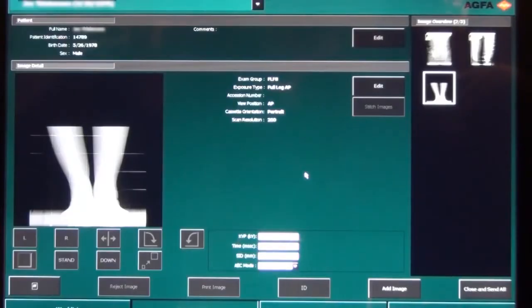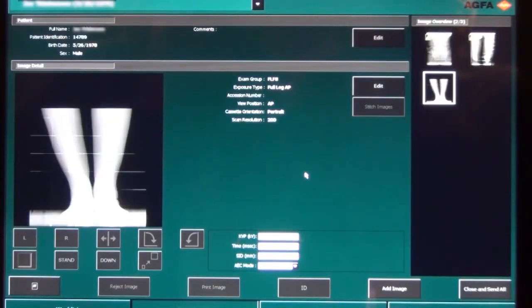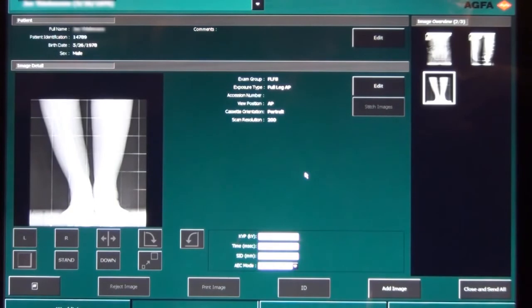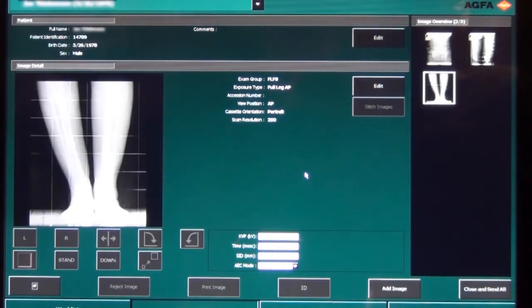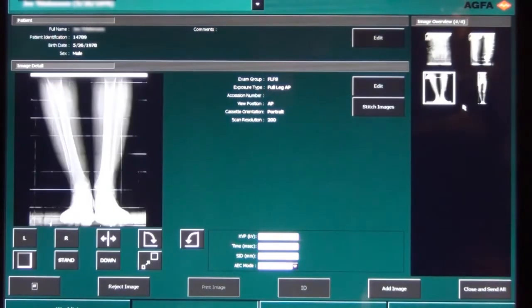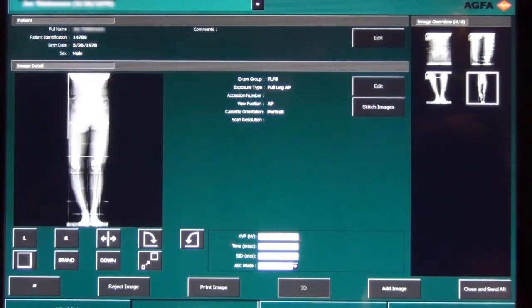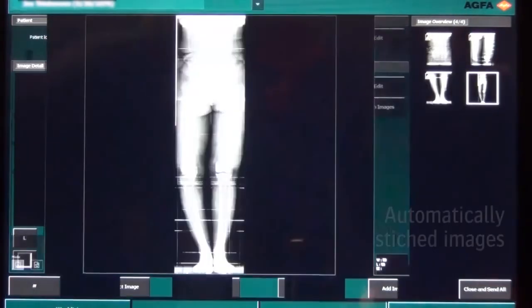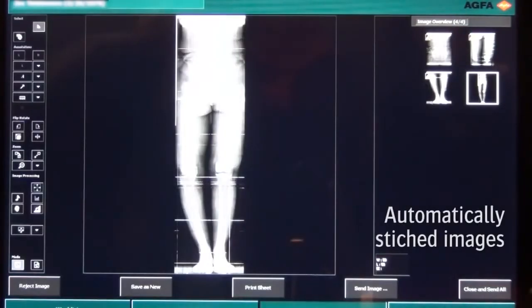On the NX workstation, the full-leg, full-spine exam is ready to receive the three separate images. Once all three images are scanned and processed, the software will automatically stitch the images.